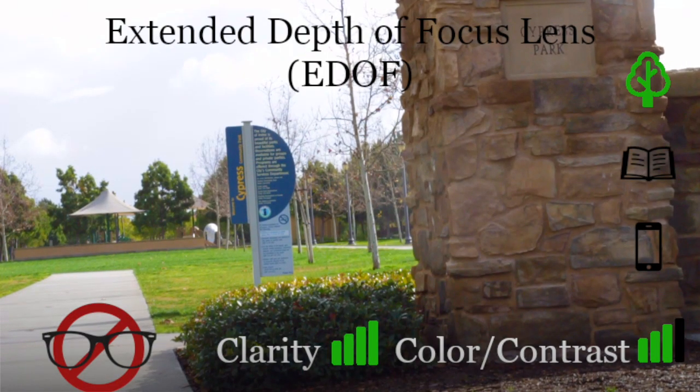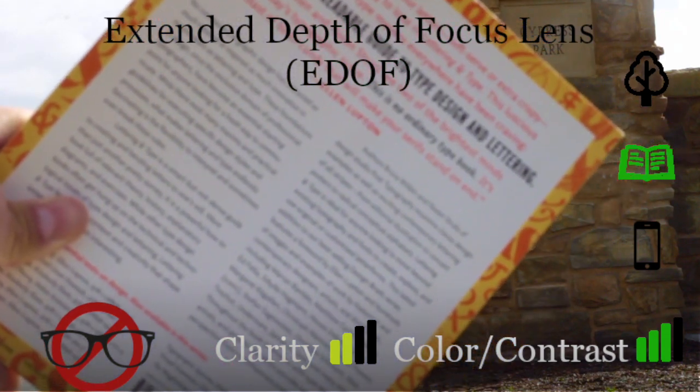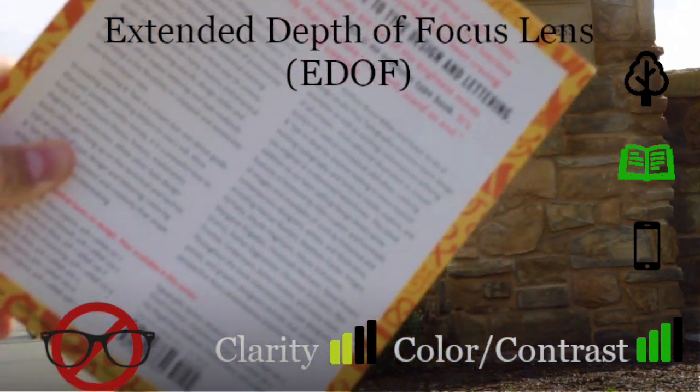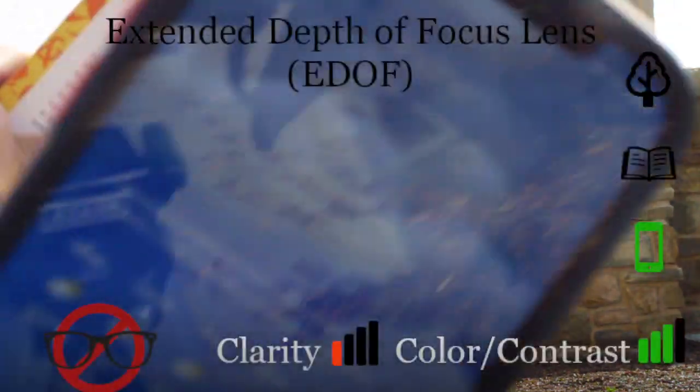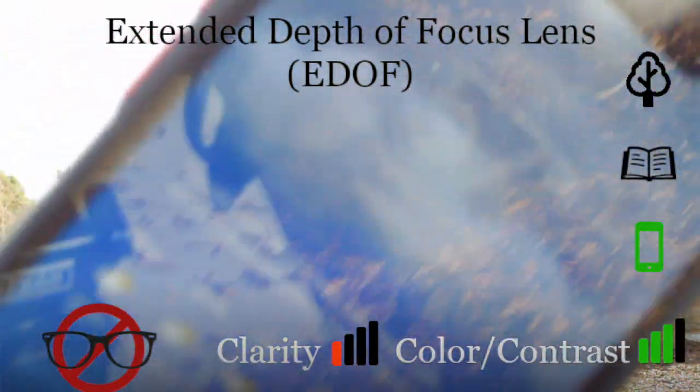Okay, let's see what that looks like. So out in the distance, nice and clear without glasses, good clarity, a little bit lower color and contrast compared to the monofocal option earlier. Now we'll bring a book out at arm's distance, a little bit blurry, but still able to make out some of the larger letters and words. Now the phone up close to your face, that's going to still be quite blurry without the glasses.